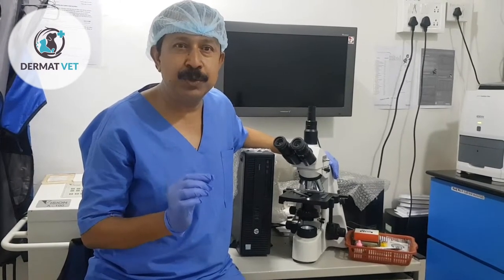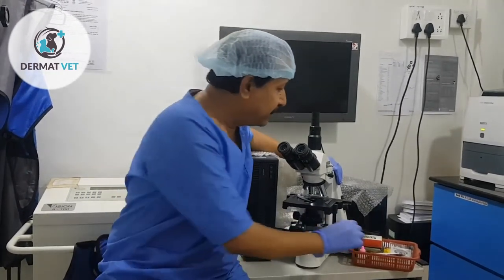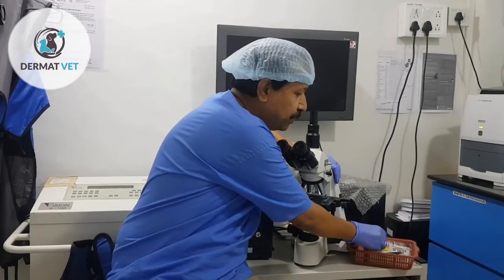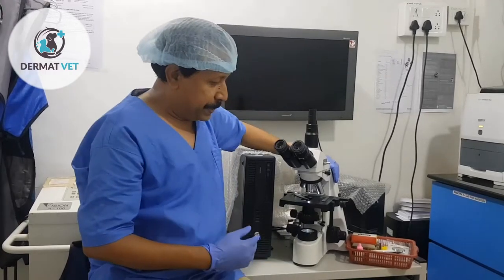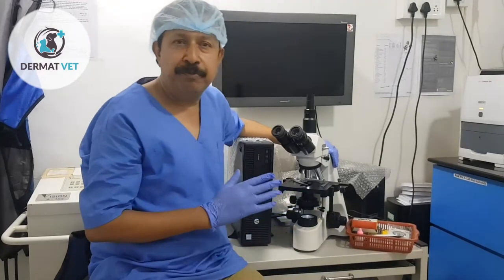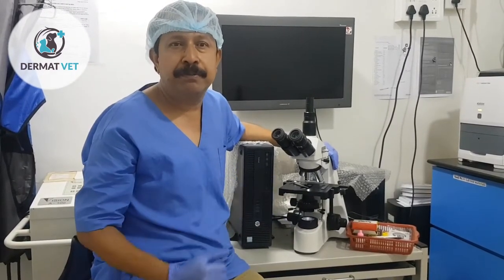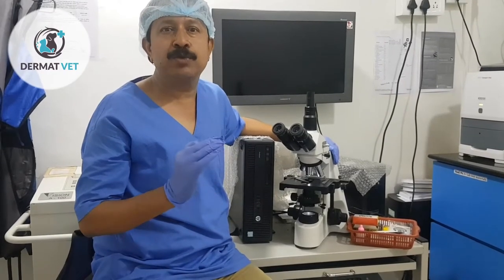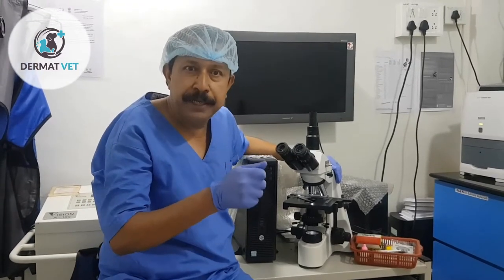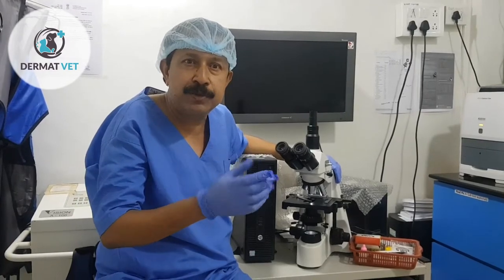The first technique is using a glass microscopic slide. This is a glass microscopic slide — it is a very simple setup, not difficult to use at all. Always use a new microscopic slide. Place the slide directly over the target area, then place a thumb over the site and gently press once.